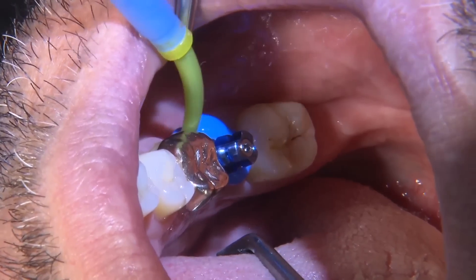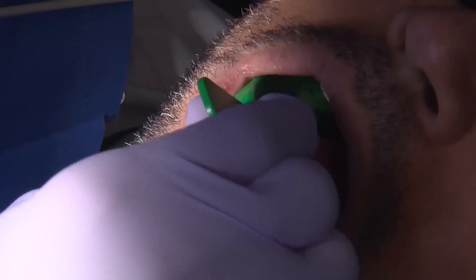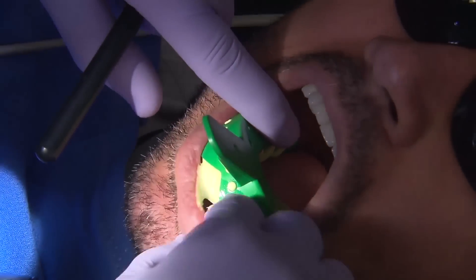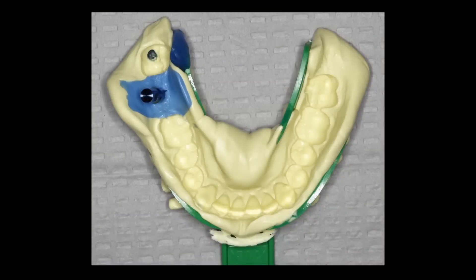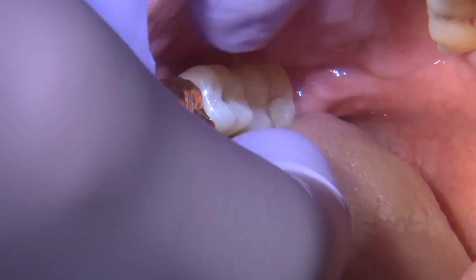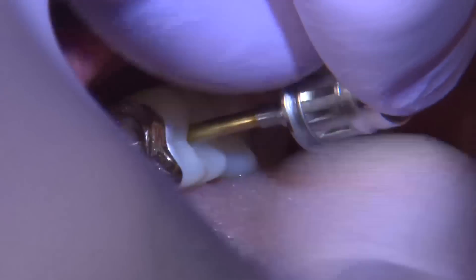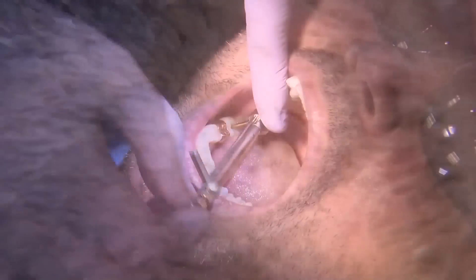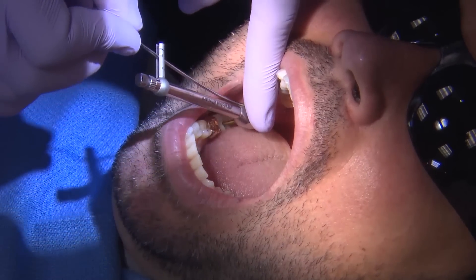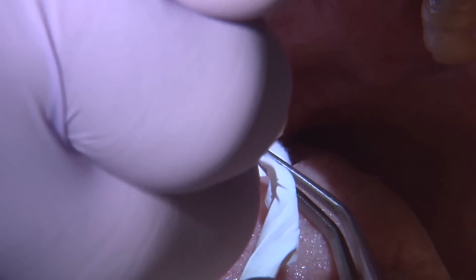I pick up the impression with heavy body material, allow it to set, then remove it and verify that all vital structures are captured. I take an impression of the maxillary arch and a bite registration, and send everything to the laboratory. The lab fabricates a screw-retained Bruxer crown. At the next visit, I remove the healing abutment, seat the implant crown, check mesial and distal contacts and the opposing, then torque the final delivery screw to 35 Newton centimeters.